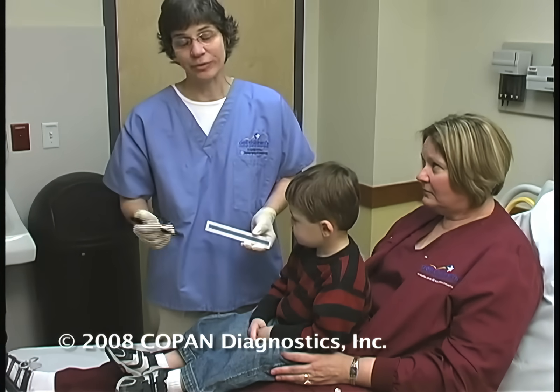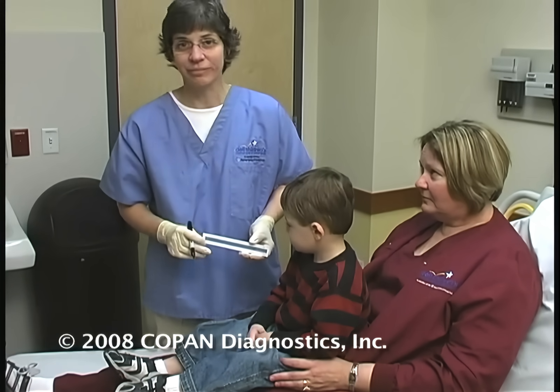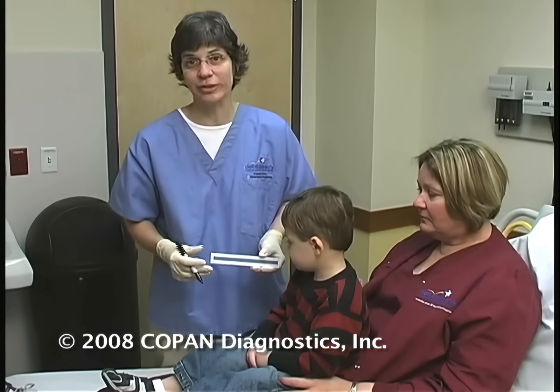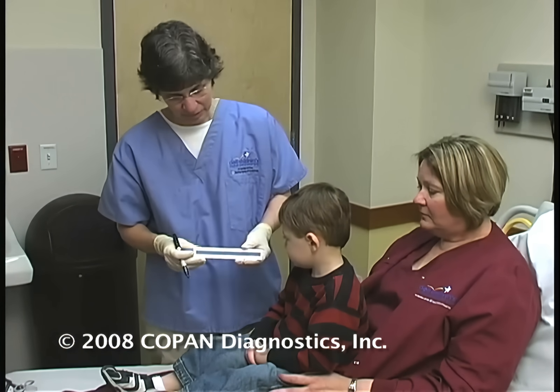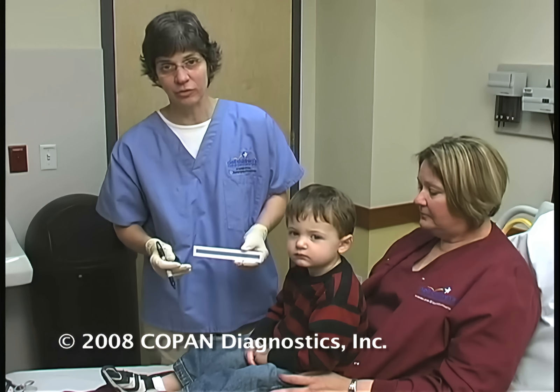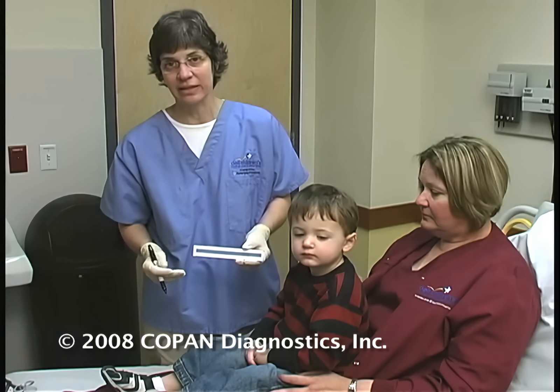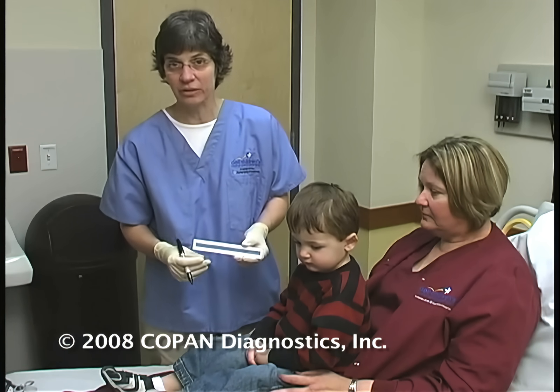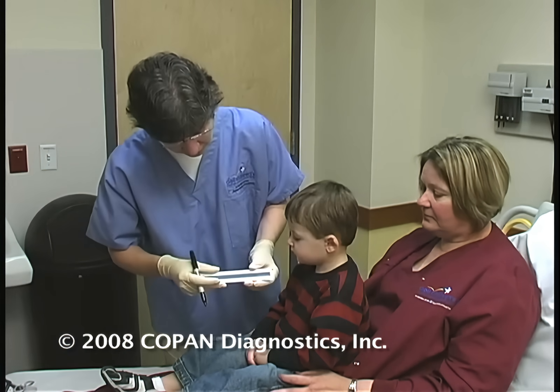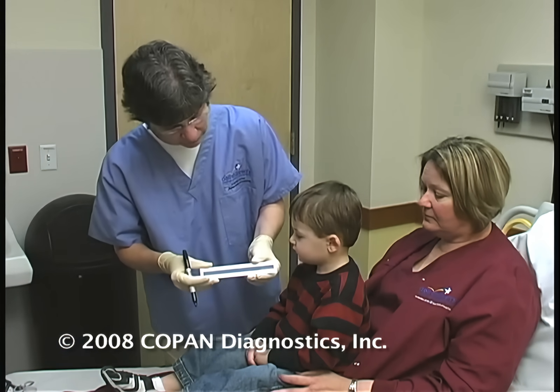I've taken probably several thousand NP swabs from anywhere from little babies up to adults, so I fairly much intuitively know where to go. But if you haven't done many NP swabs or are a little uncomfortable with it, I'm going to show you a quick, easy technique to help ensure that you're going the right depth and getting an adequate sample.